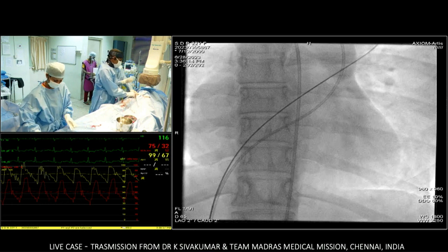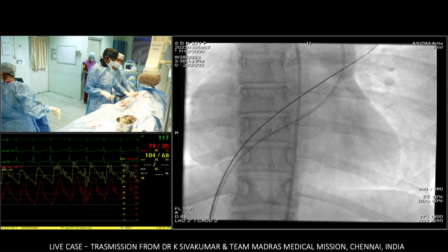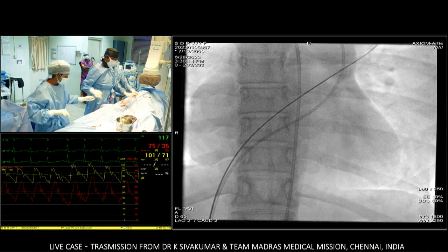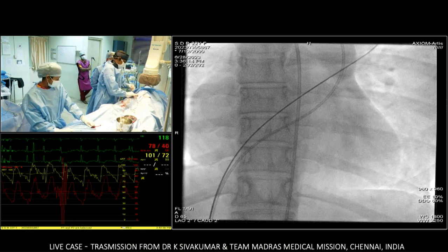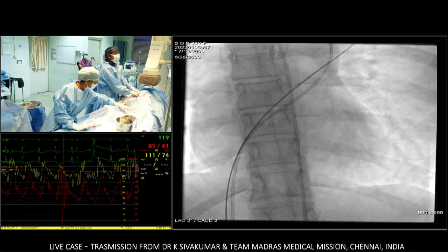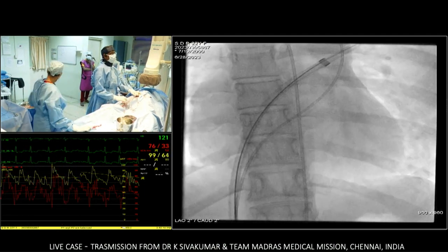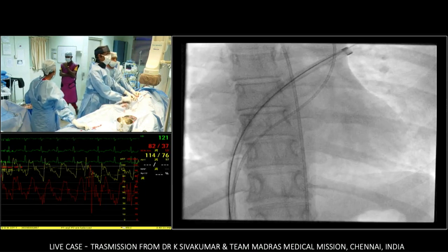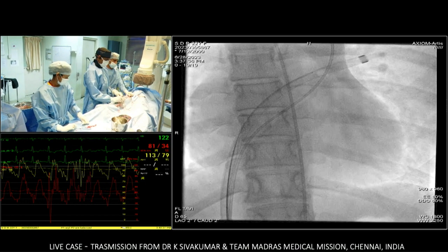So, Eric, you alluded to this. How many in the audience would consider complete closure, perhaps with ongoing treatment with PH therapy, and then not doing a fenestrated closure? Complete closure? Show of hands? Okay, we have a handful of us who might be brave. Fenestrated closure? Similar. 51 to 49. Maybe. We could Brexit on that.